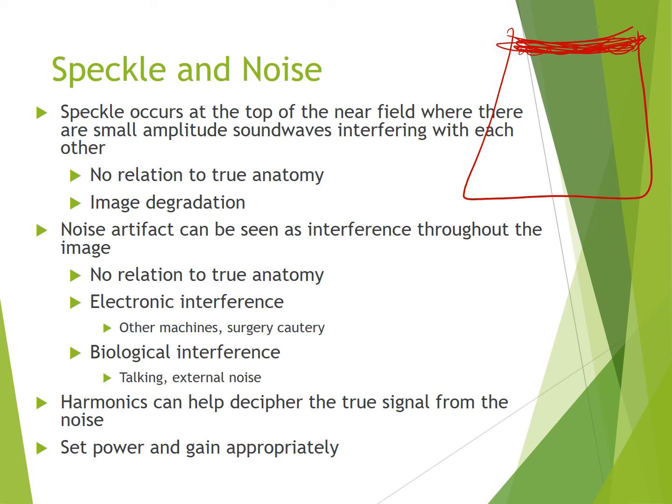It is not going to be displaying true anatomy, and it's going to actually degrade our image quite a bit right in those first few centimeters of the image. So that is why it's considered artifact, because it's not true anatomy. We're not truly seeing the skin layers like we would expect, because those are the first things that the sound is going through.